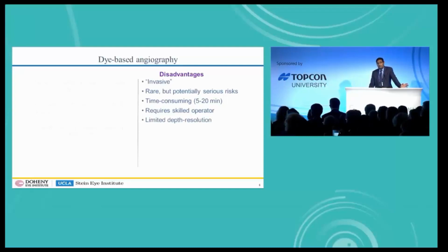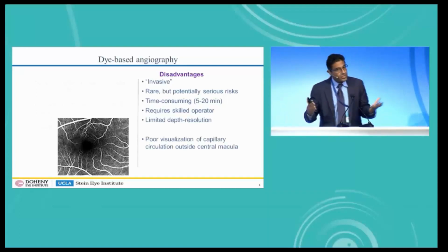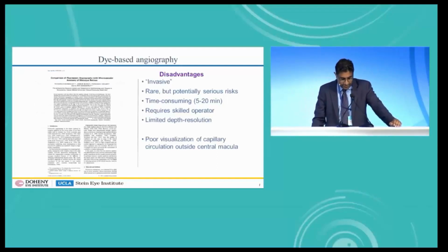The other thing, and I'll emphasize this point through the course of this presentation, is that the depth resolution is somewhat limited. I pointed out that you get nice visualization of the capillaries, but really it's just a very central macula that you can see them in. Outside of this area, they're not really well seen.